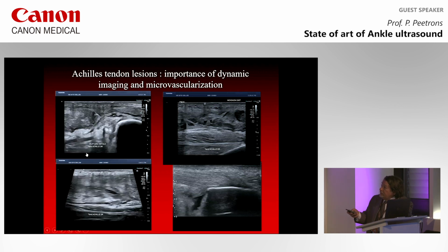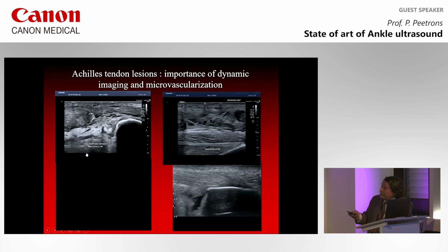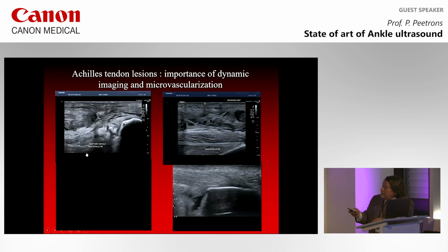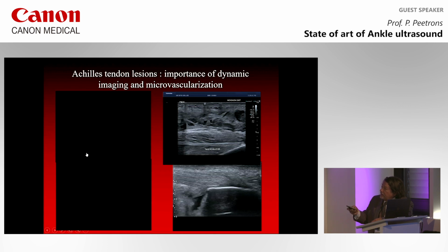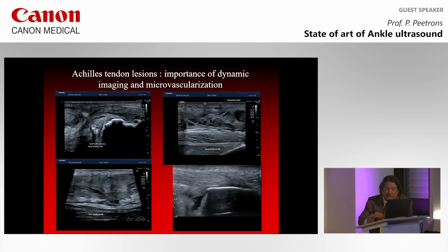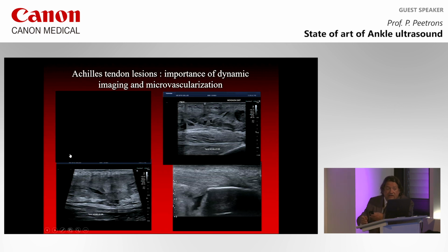I moved the foot, and you see that this is not moving at all, or in fact it is moving on the other side. You can see that when the ankle is going there, the tendon is going that way. So there is no tendon at all on the calcaneus. This is very important to tell the surgeon because he has to fix the tendon to the calcaneus. He doesn't have to repair the tendon, he has to fix it to the calcaneus. There is no tendon on the calcaneus.